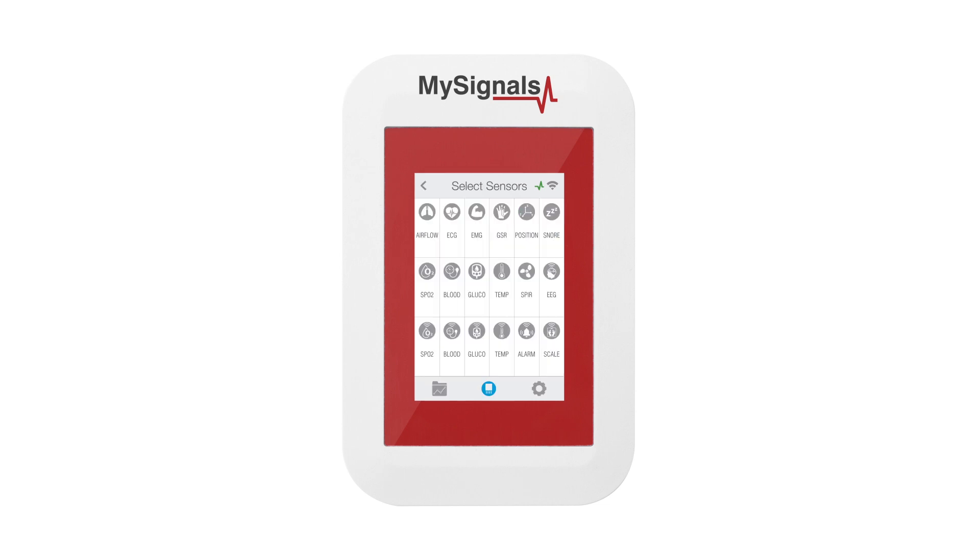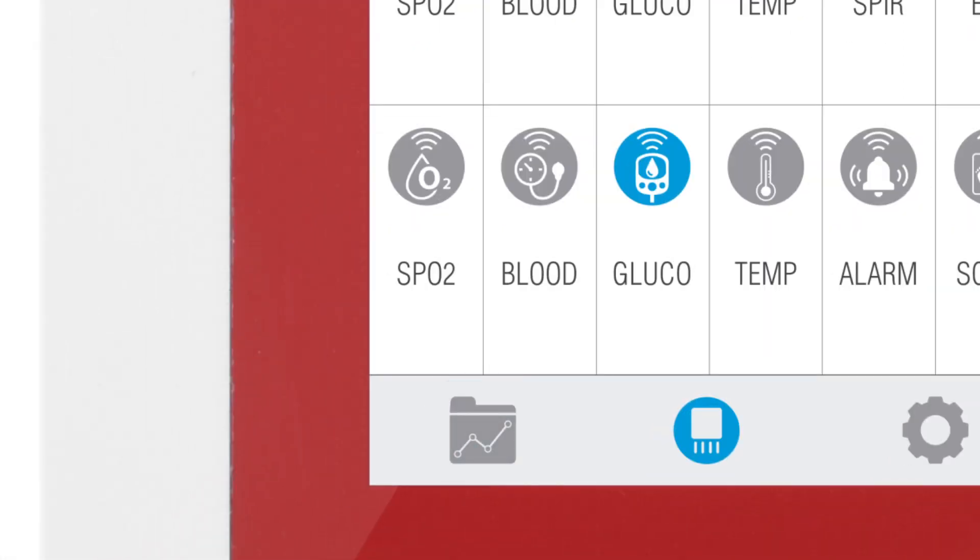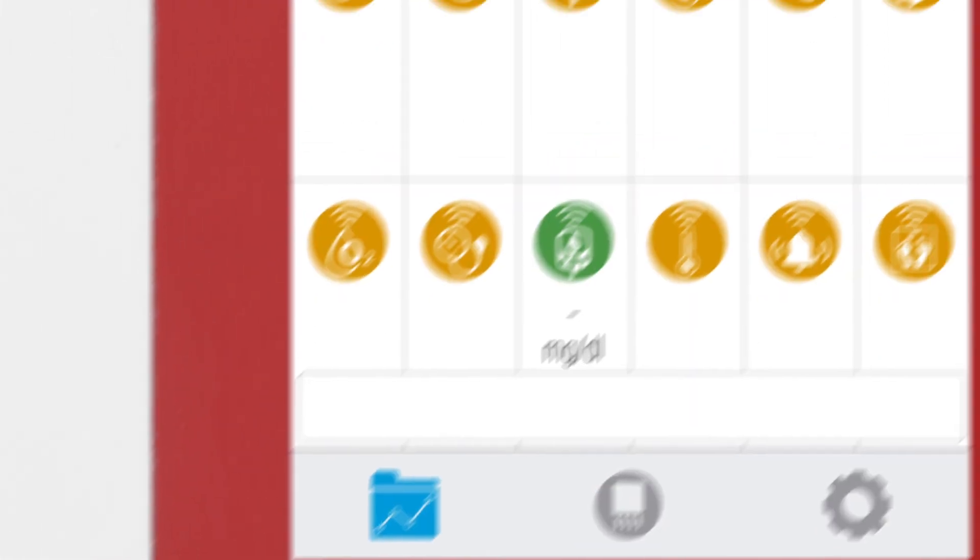In the sensor selection screen, you can see all the sensors available. By selecting the Glucometer Bluetooth Low Energy Sensor, the icon will turn blue. Then click on the Data button to access the data screen and start visualizing the data.